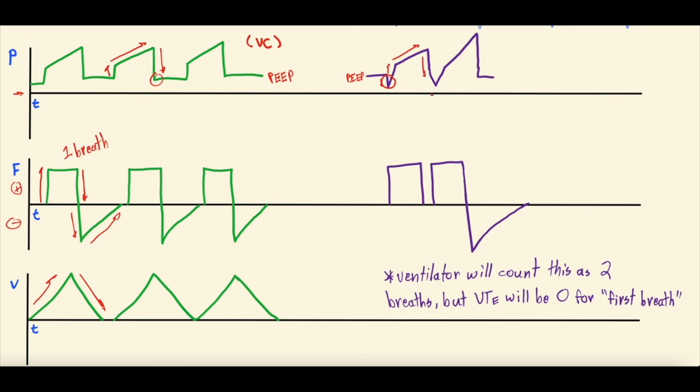But when it comes back down, it doesn't just go to the normal end expiratory pressure, that normal PEEP. It goes below that, you can see here. And what that is, the patient is still trying to inspire, trying to continue to take their breath in. So you see that negative deflection again, and the vent says, oh shoot, they want another breath, so it gives them a second breath. And that is all in a row. They trigger 2 times, or double trigger. And that's what this pressure scalar will look like for double triggering.